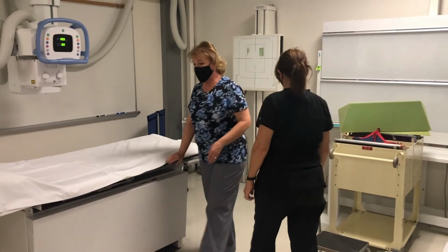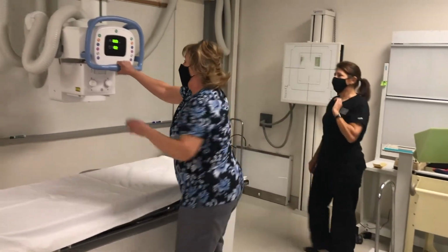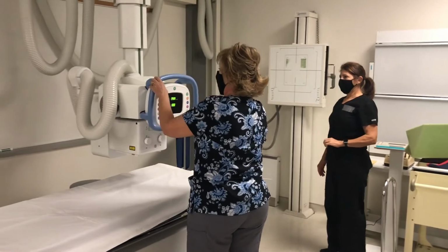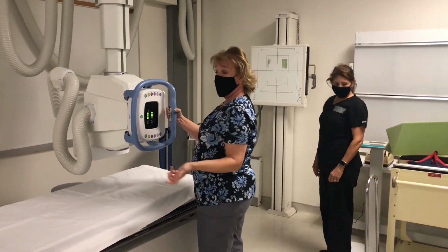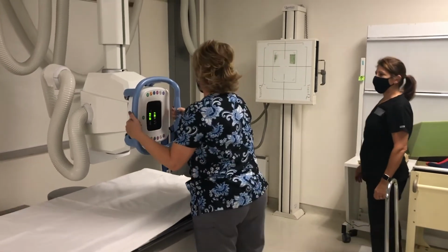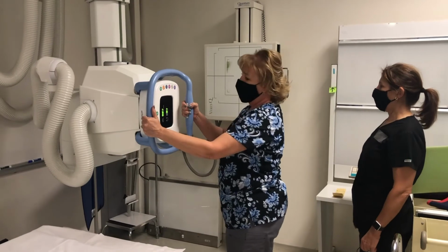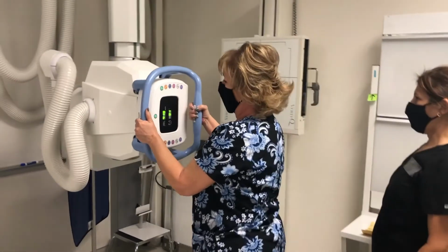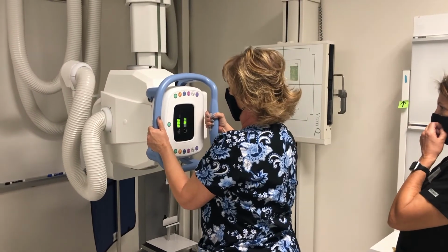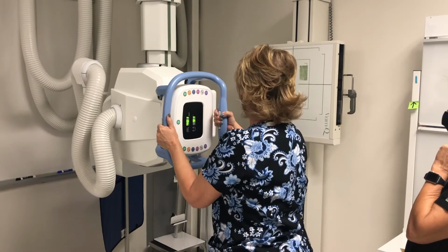Okay, so while she's in the bathroom, I'm gonna set up for my upright post void. Anytime you hear post, it's the opposite of pre, so it's after something's happening. So a post void is after voiding. So I'm gonna do this at 40-inch SID.